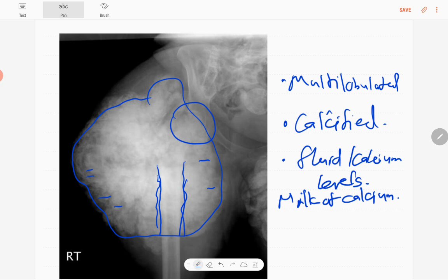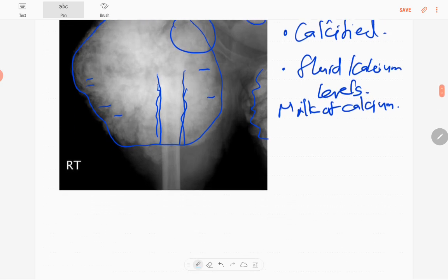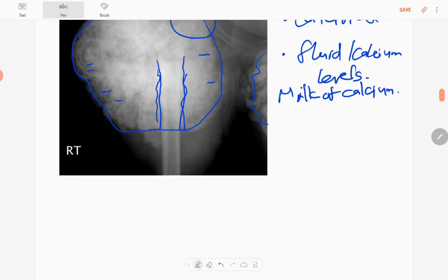So this is a calcified soft tissue mass in the region of the right hip joint. There is an incidental finding of a probably calcified fibroid in this region as well. The left hip joint also appears to be affected by the same condition, suggesting it is bilateral. The diagnosis in this case is tumoral calcinosis.